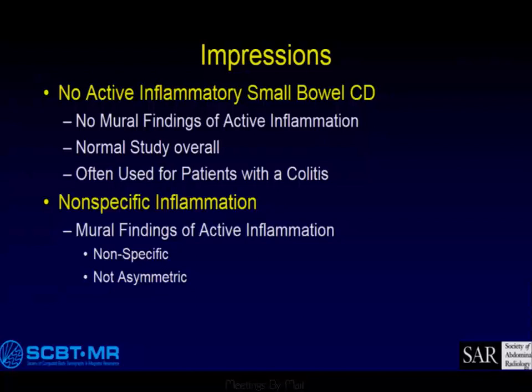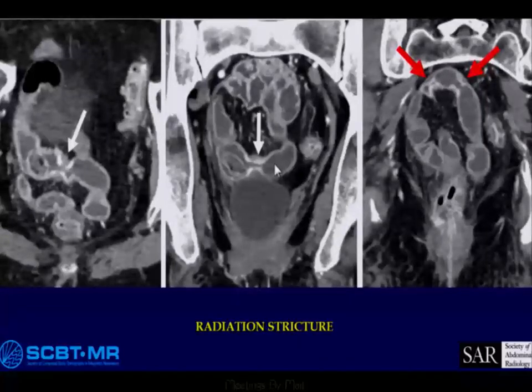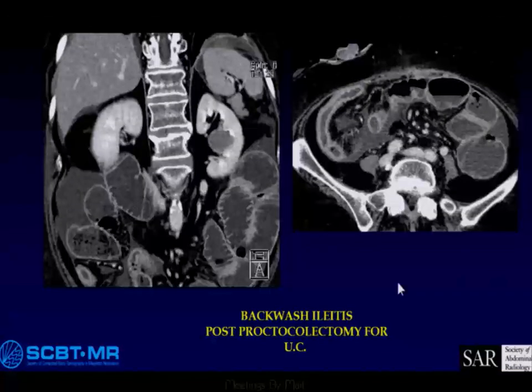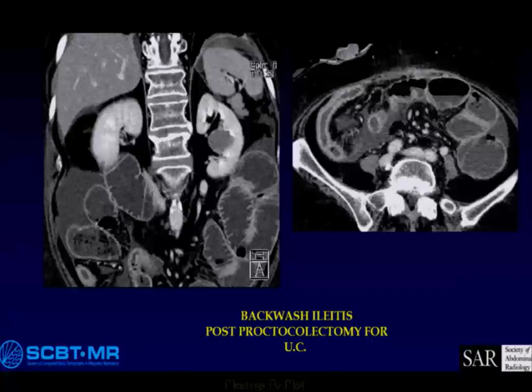I don't use nonspecific very often because most of the patients I see already have known Crohn's disease. Here are a couple of examples of nonspecific inflammatory change: this is a radiation stricture, and notice that it's pretty symmetric — not asymmetric. Here's a patient with backwash ileitis after a proctocolectomy for UC — I put this in quotes because about 15% of patients with indeterminate colitis who have a colectomy will develop Crohn's disease in the future.